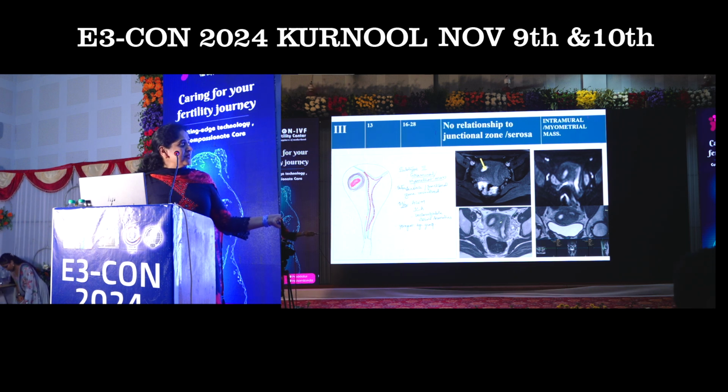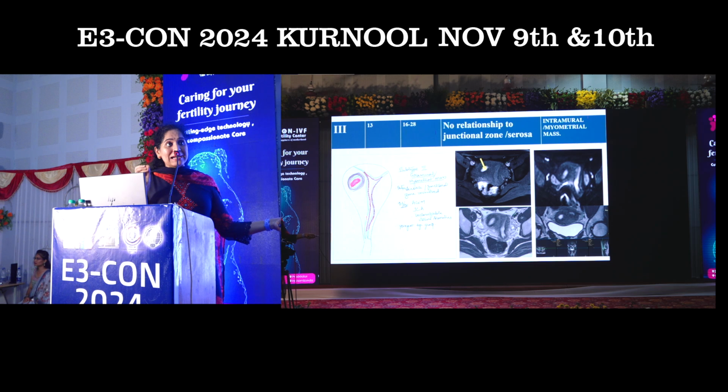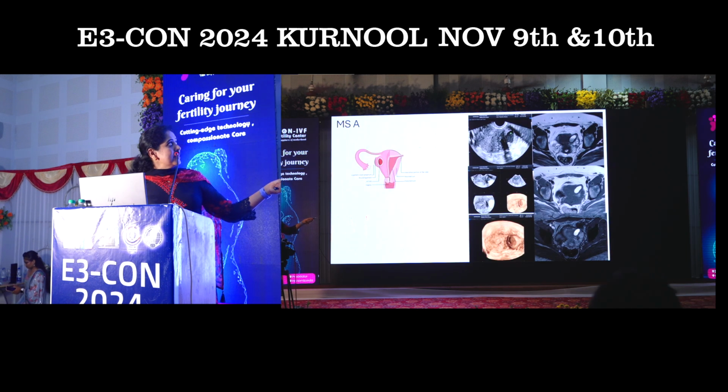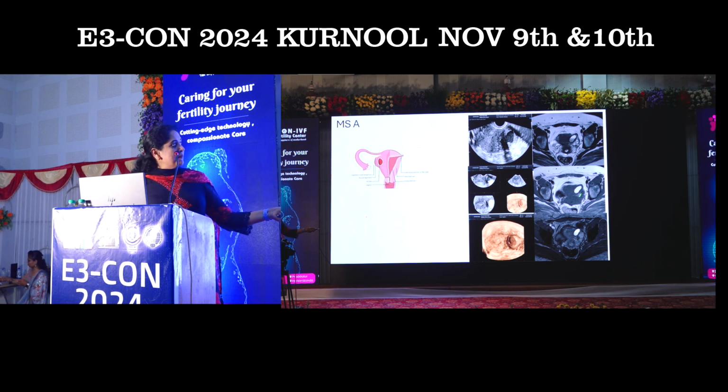So they represent the presence of ectopic endometrial rests within the myometrium. So this is type 3 or the third pattern of phenotypic manifestation of so-called adenomyosis. So this is what is called as ACUM. They represent cystic fluid filled structure within the confines of the uterine serosa and they can be confirmed on MRI by their blood signal characteristics.